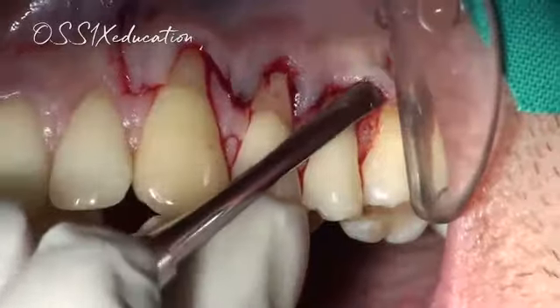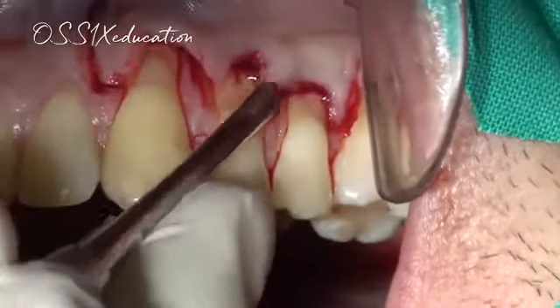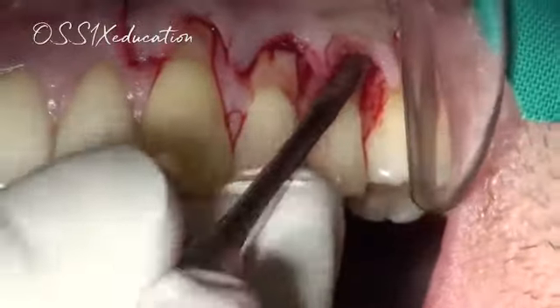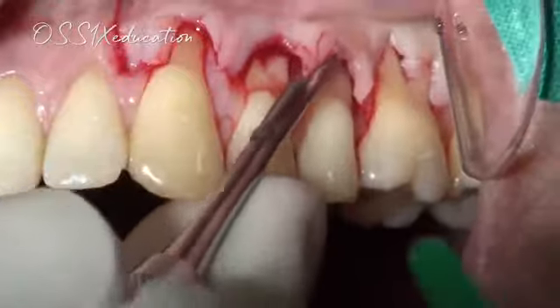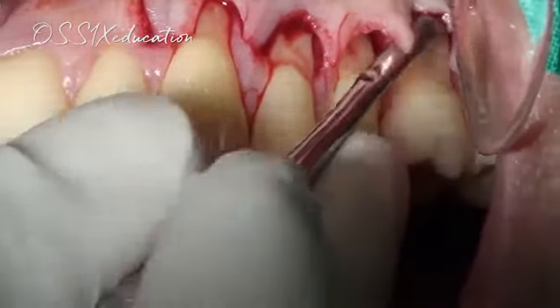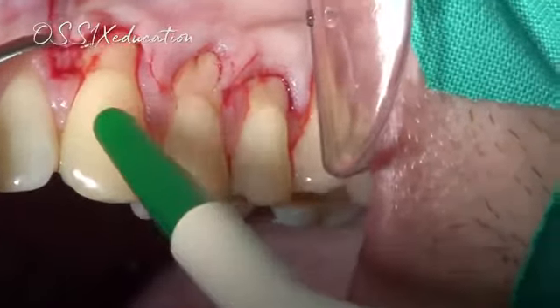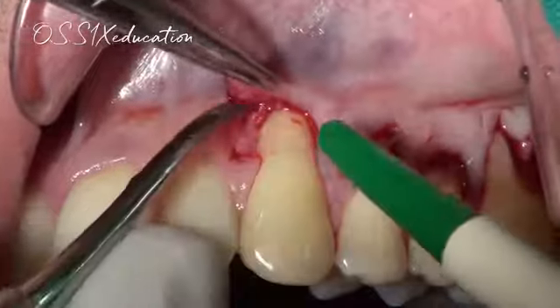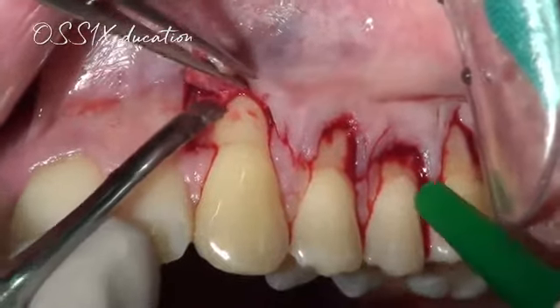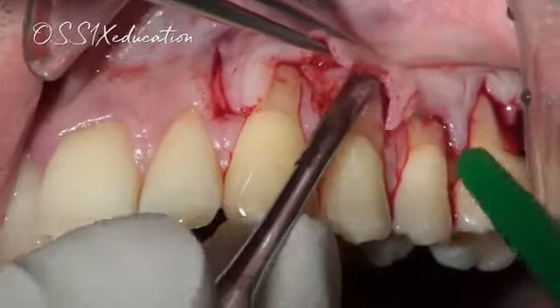With a small periosteal elevator, we're gently raising the flap one tooth at a time. Sometimes it doesn't go so easily, but we're doing it bit by bit. We don't cut on the buccal side, so we just cut the tissue in the papillary area. Here we have some obstruction on the vertical releasing incision, so we're going to gently and carefully, with a sharp periosteal elevator, release and cut the attached connective tissue to the underlying bone. And now we can see the outline of the bone.